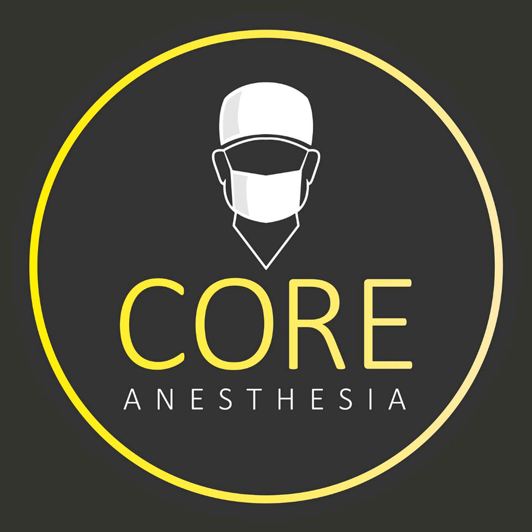But there are also some times where if you have a patient that's pretty calm and relaxed, you can do that right away. I sometimes will put this strap and secure that mask onto their face, and then that mask is going to be staying right there, supplying oxygen at 100% FiO2 while I go ahead and hook up the rest of the monitors and do my thing. And that just starts that 3 to 5 minute process right off the bat.